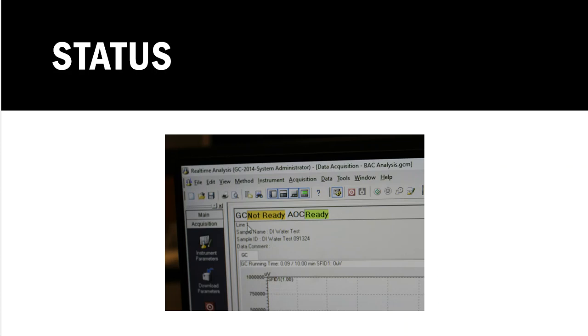All right, good news. We're getting closer and closer to running a sample. Thank goodness. Woohoo! Fewer videos that you've got to watch and fewer videos that I have to make. We both can celebrate.